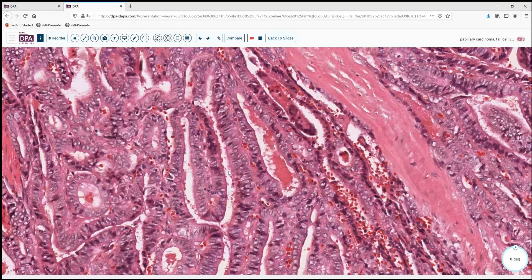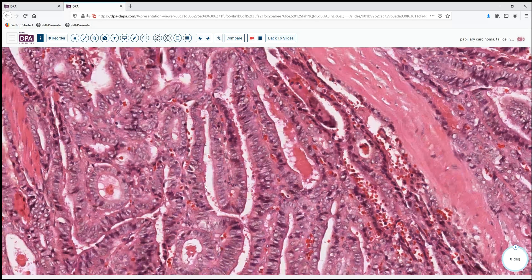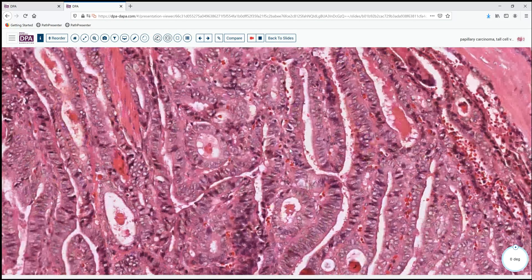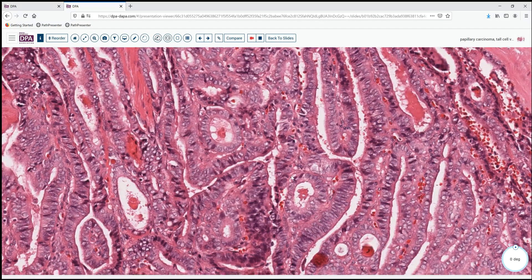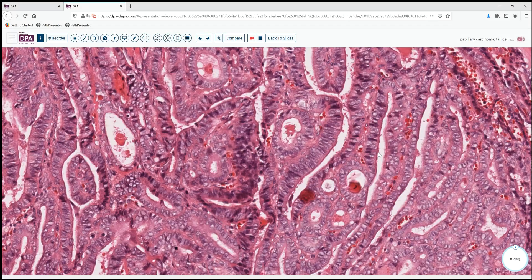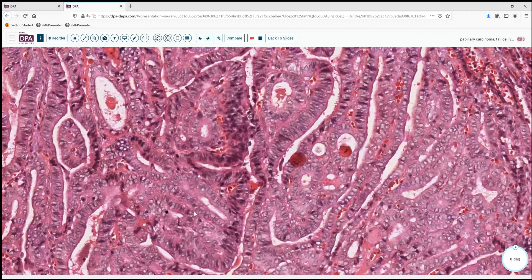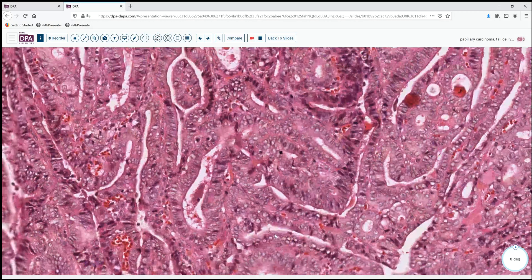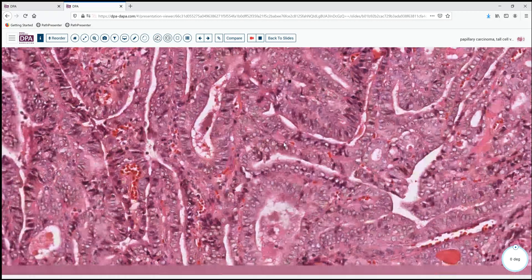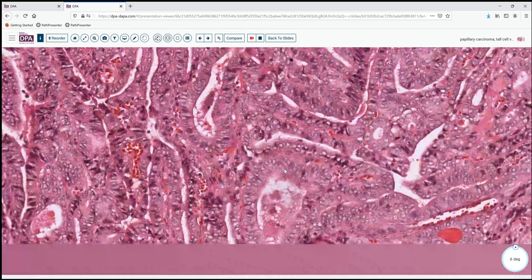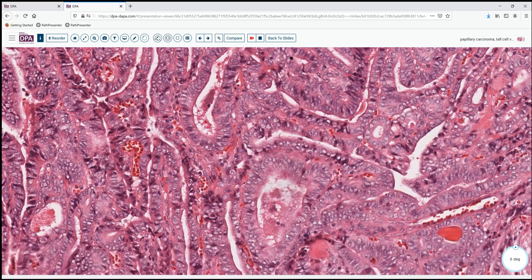We see that in this area here. And so once we get to an area where 20, 30 or more percent of the tumor has that type of configuration, we start to be concerned about a tall cell variant of papillary carcinoma with these nuclear features.